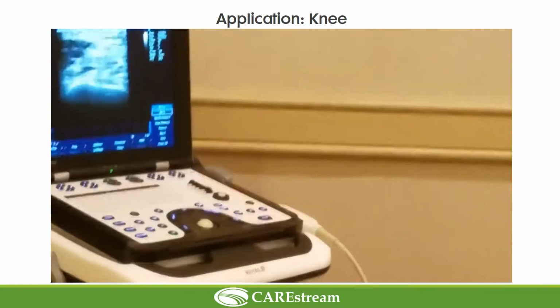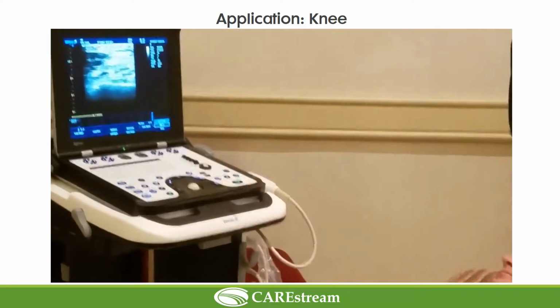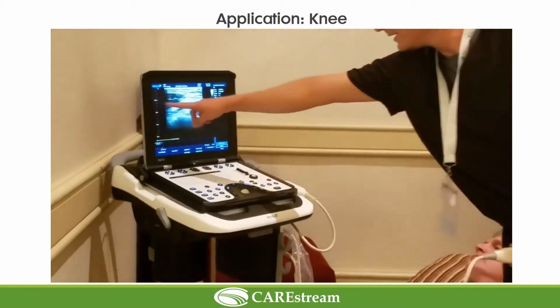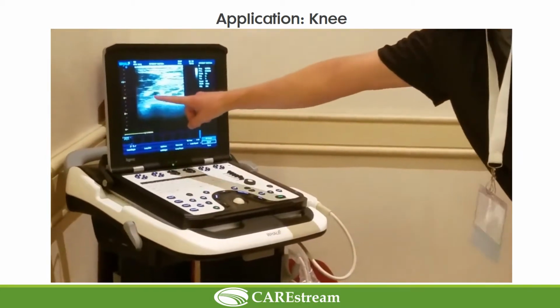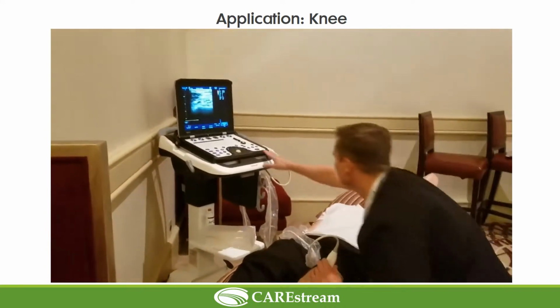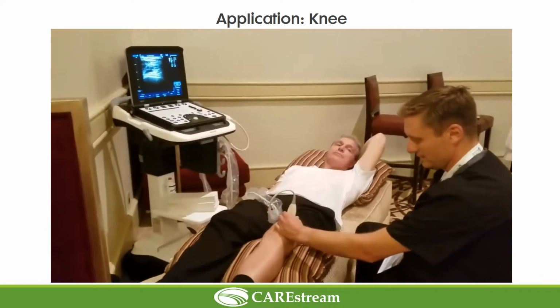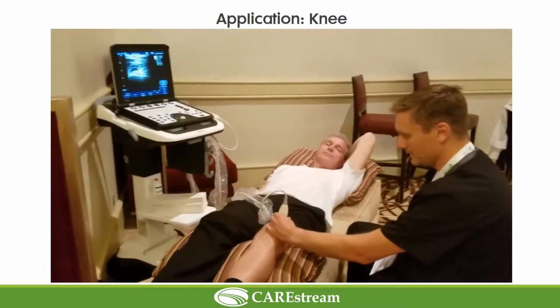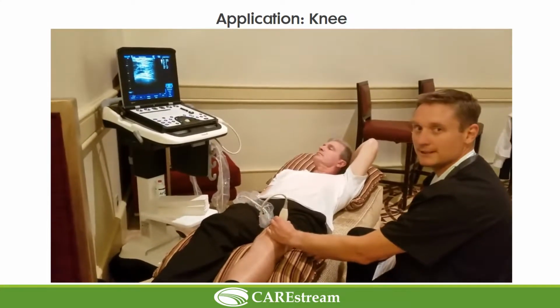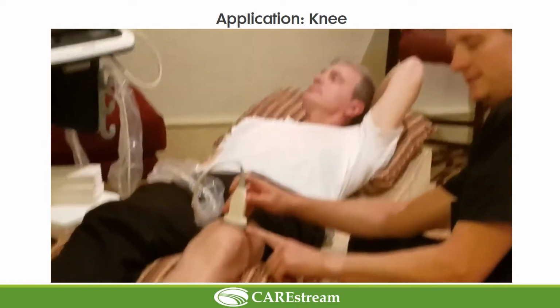Okay. So real quickly, I'm going to note mentally how deep this is. Look on the side of the screen, 1 centimeter, 2 centimeters. Corresponds with the recess. From the probe, I'm going to travel 2 centimeters, which is a little bit less than an inch, down the leg. Okay. So here we are, about 2 centimeters down from the probe.